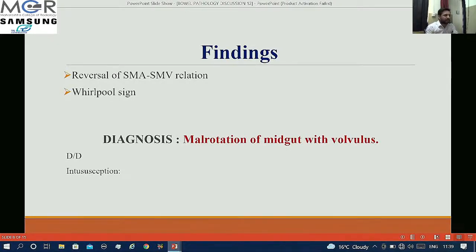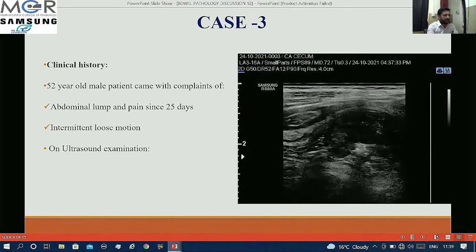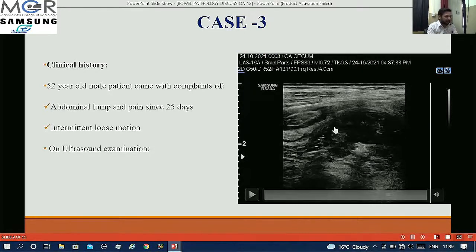To clarify: the target sign is seen in intussusception whereas the whirlpool sign is seen in volvulus. This is case number 3. A 52-year-old male patient came with complaints of abdominal lump and abdominal pain since 25 days. He was also having intermittent loose motions.